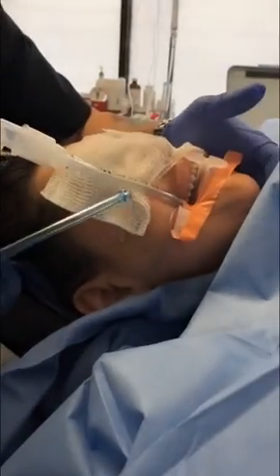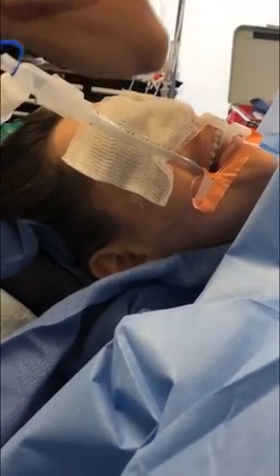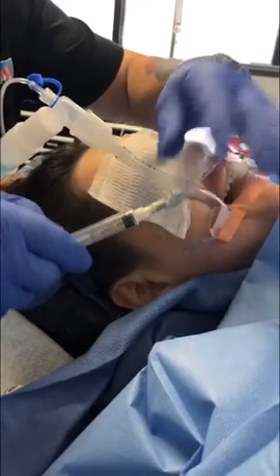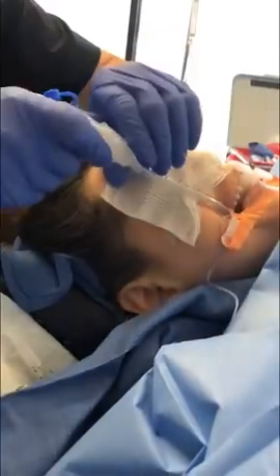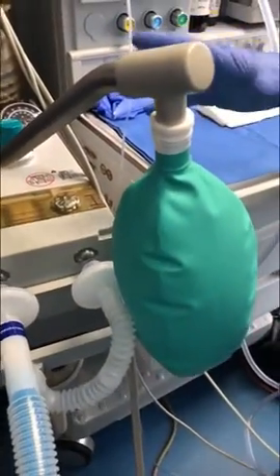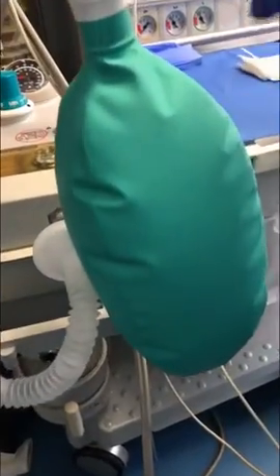I did find somebody to video for me — Larissa, thank you very much. I'm going to suction out her oropharyngeal airway. See all that goop there? That stuff could have gone down into her lungs if I didn't take it out. I'm going to take the air out of the pilot balloon and hook this up to my mask to have it all ready. Let me support her airway — as you can see, I've got my C-formation. Airway's in there, she's breathing spontaneously. Notice my hand has not left the mask — I'm not squeezing the bag. That's her breathing on her own.